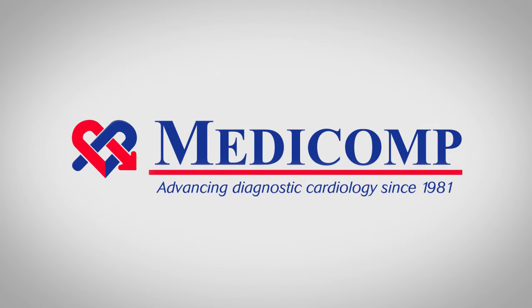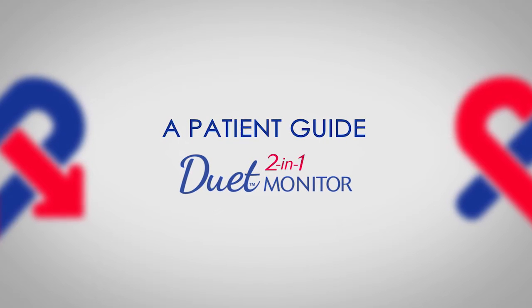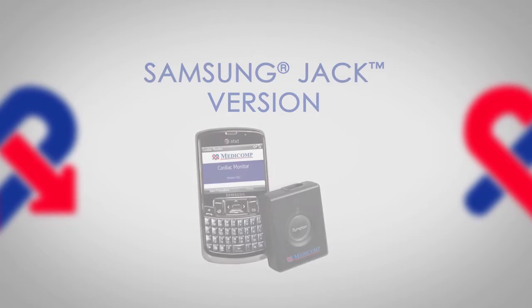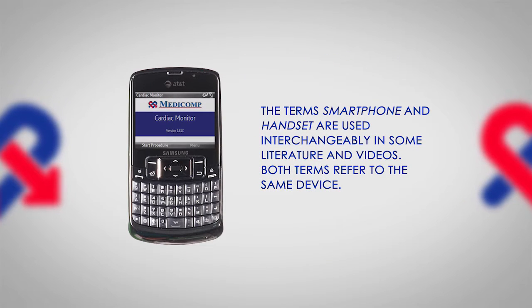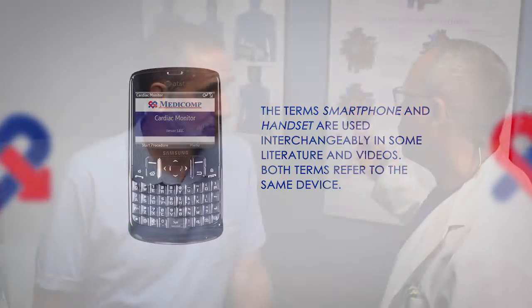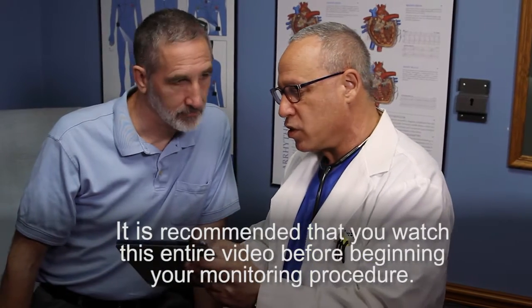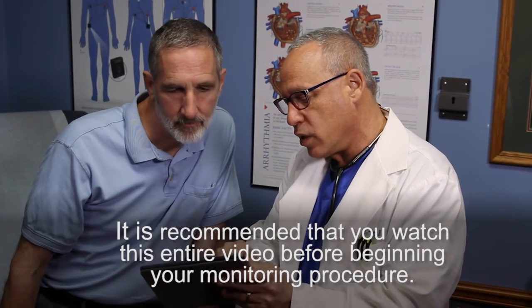Welcome to MEDICOMP. We've been advancing diagnostic cardiology since 1981. MEDICOMP presents a patient guide for the DUET 2-in-1 monitor, Samsung Jack version. Your doctor has prescribed the DUET Cardiac Monitor, and entrusted MEDICOMP to help identify possible cardiac arrhythmias. To provide your doctor with the most accurate information, it is recommended that you watch this entire video before beginning your monitoring procedure and fully review the documentation included in the kit.